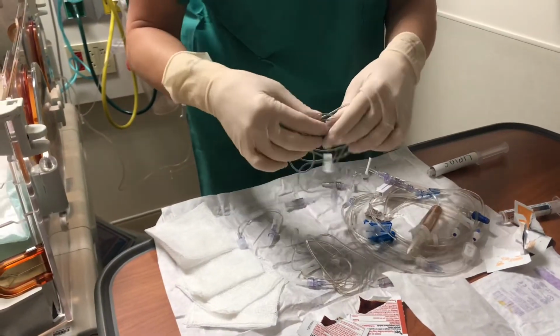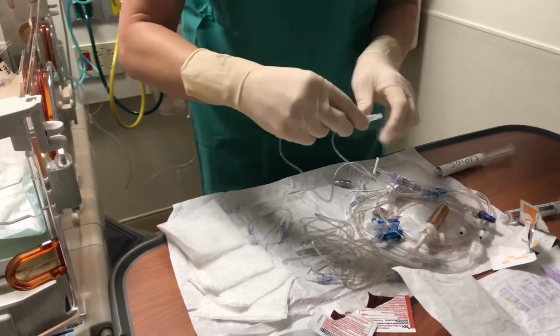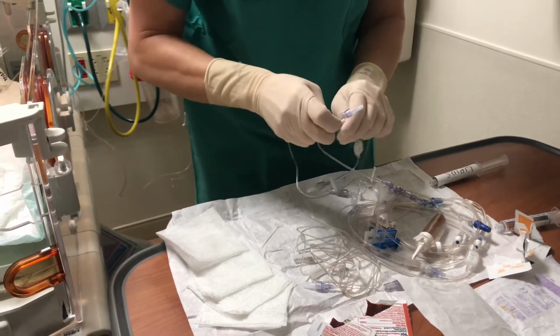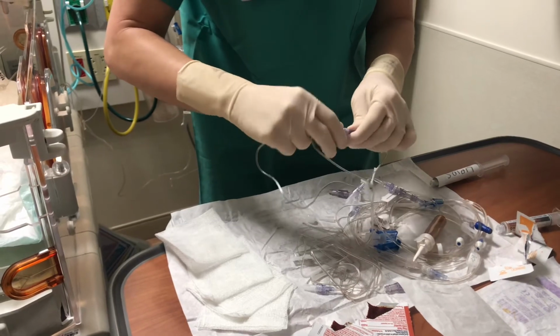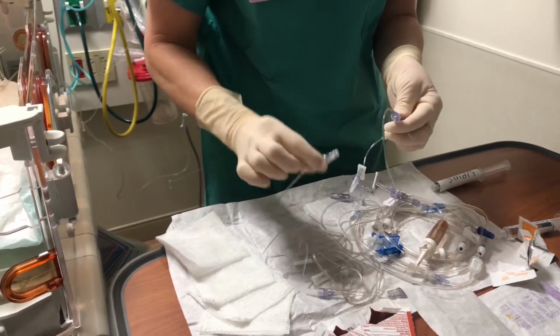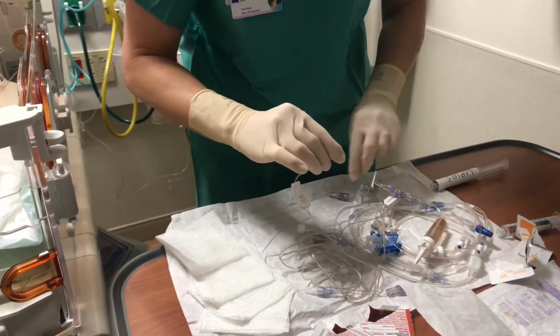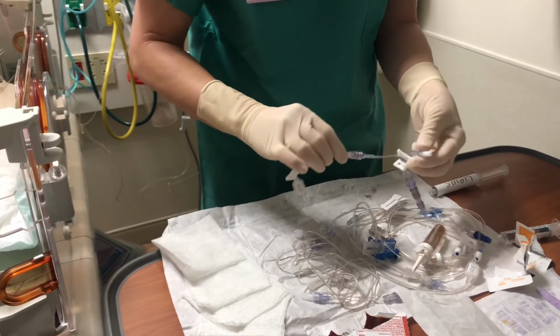Okay, I'm going to attach my lipid tubing to my lipid filter. Remember, again, that's the larger micron, the 1.2 micron. And I have my clave here at the end that's going to go to my syringe. So then I'm going to connect my filter to the other clave that's on the other end of the bifuse.